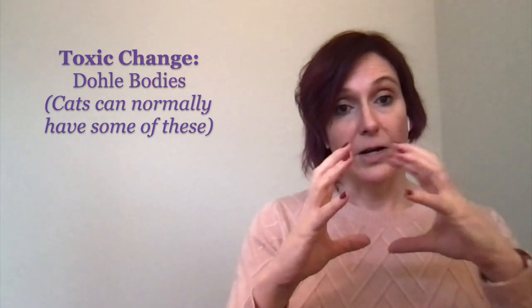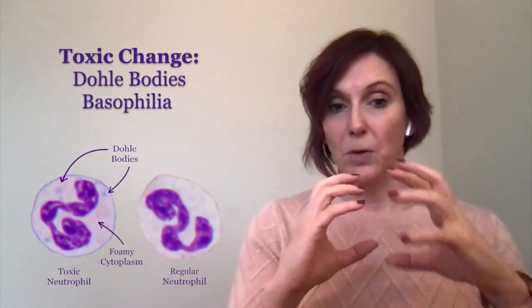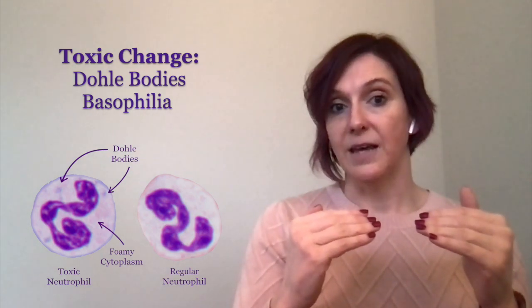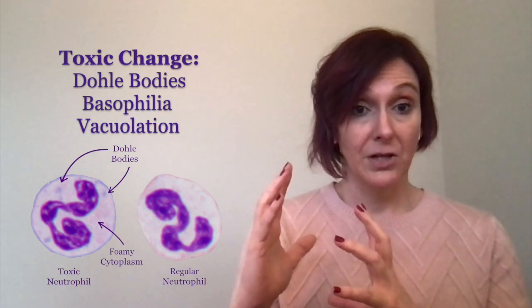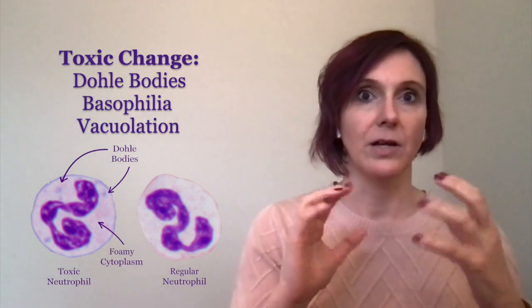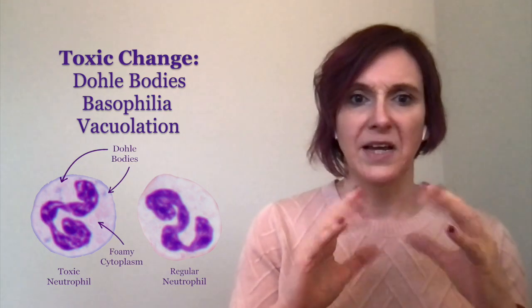Basophilia, so that cytoplasm starts turning a little more blue. All the RNA in the cells are picking up that blue stain. So they start turning a little more blue, and we may start seeing vacuoles on them, and they kind of look like foamy, dish soap vacuolation to these neutrophils.